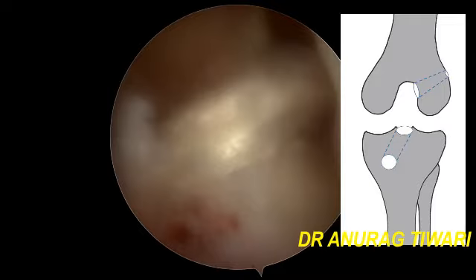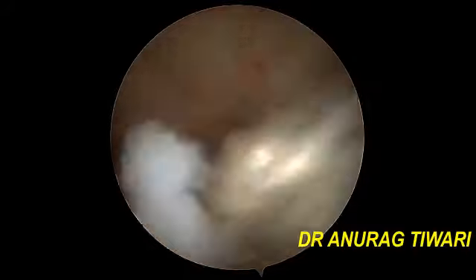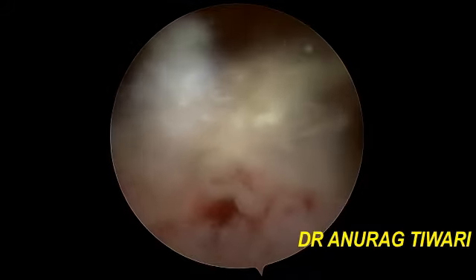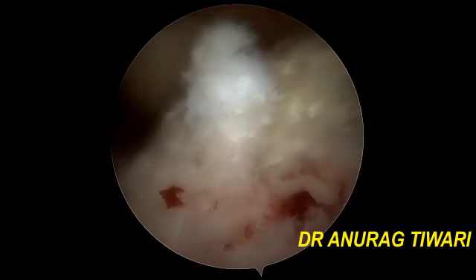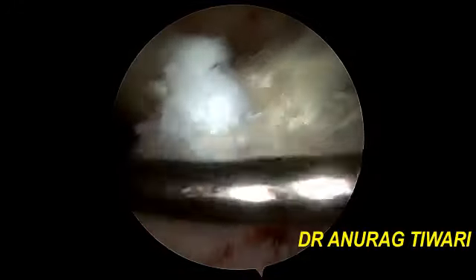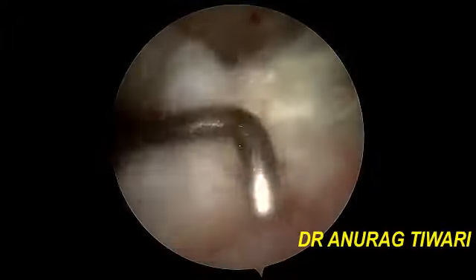So this is the picture you can see of the femoral tunnel and the tibial tunnel we have drilled. On the femoral side we have fixed the graft with the endo button. In this case we have used the adjustable endo button. And on the tibial side we have used the suture disc in order to fix the graft. So this is a suspensory type of fixation. And these white fibers are of the native ACL. We have preserved the remnant of the ACL on the tibial footprint. This is again important because this gives a good proprioception and a good fixation of the graft.